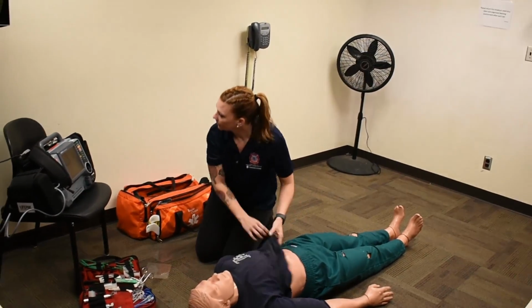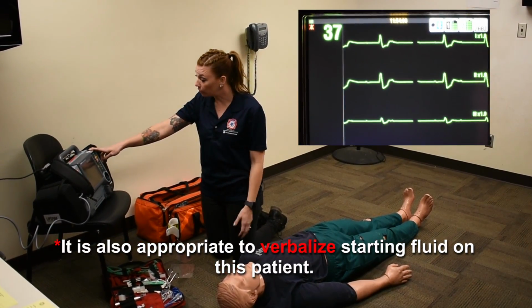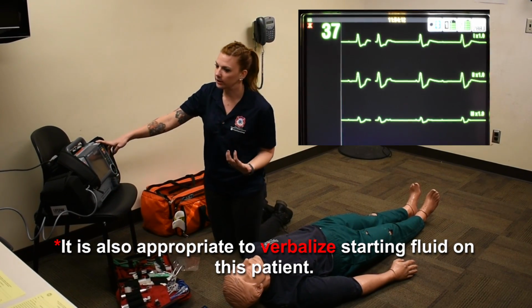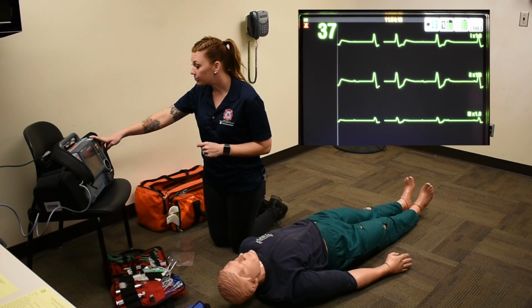Okay? I'm going to go ahead and turn my monitor on. At this time I'd get an IV started. His blood pressure was quite low, and probably put him on some oxygen, maybe like 2 liters nasal cannula. Actually, it was 88%. Let's do 12 liters with a non-rebreather. Looks like we have a third degree heart block.